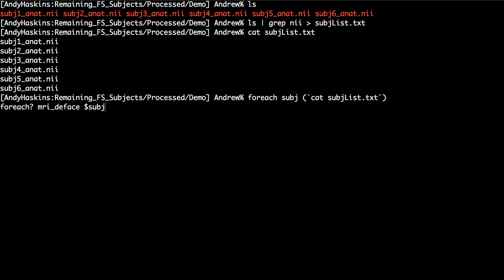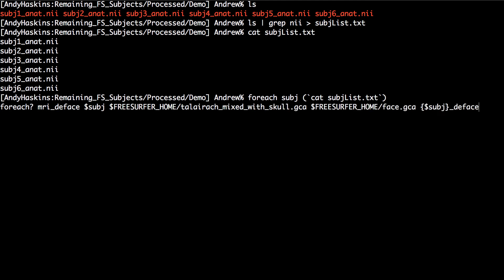For example, to run MRI D-FACE on all the subjects in this directory, type the following. This code is available in the text box down below.